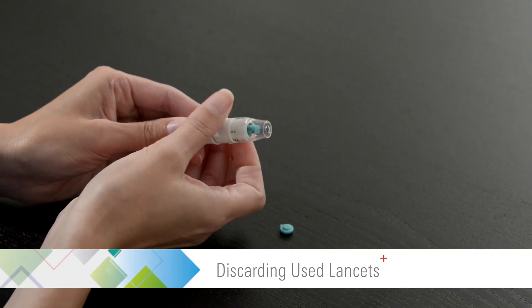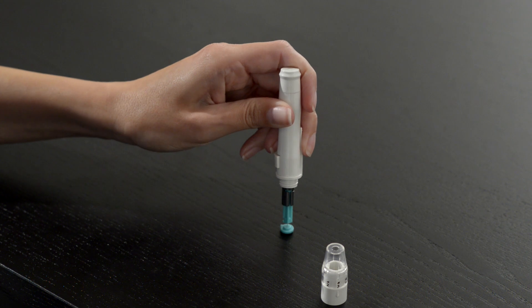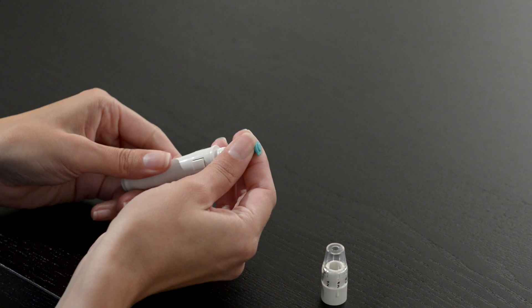Unscrew the lancing device's adjustable cap. Place the protective cover on the lancet and dispose of it in a proper biohazard or puncture proof container.